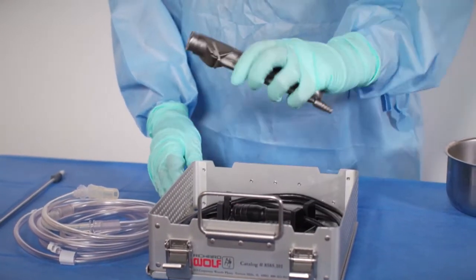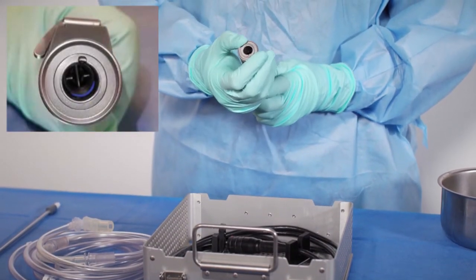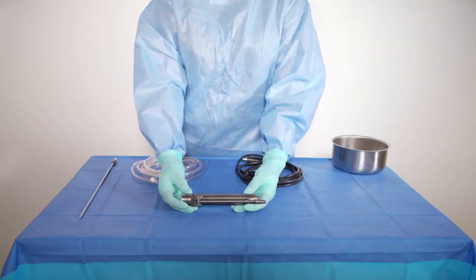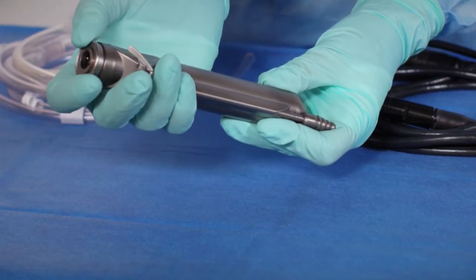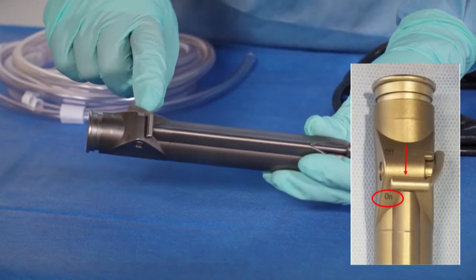The sterile team member should immediately check for the blue o-ring, which is inlaid about two-thirds of the way down in the clamping head of the power stick. The power stick components are as follows: the suction port, the clamping head, and the suction control valve lever, which is always in the on position.